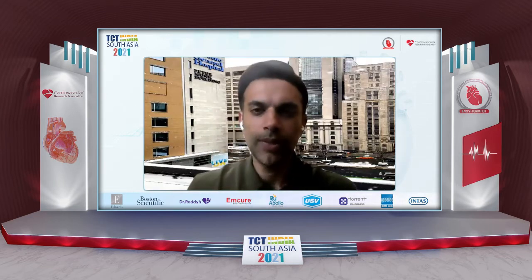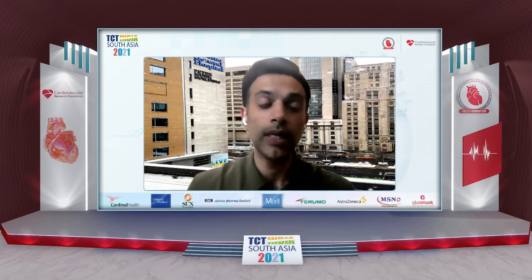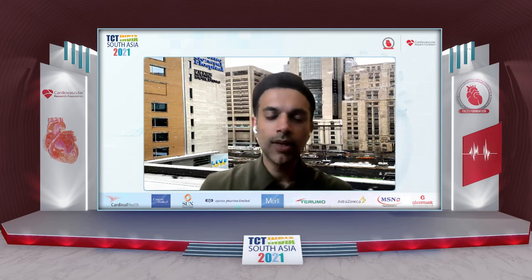Yeah, that's a great question. In my opinion, and I realize that there are differences in different markets across the world, but in CTO PCI, I use IVUS in 100% of my CTOs because they're too difficult. The procedure is difficult as it is, right? Why make it harder by trying to guess, right? The tissue is calcified. The tissue is difficult to expand. The tissue is difficult to understand. So, we need more information than the angiogram provides.